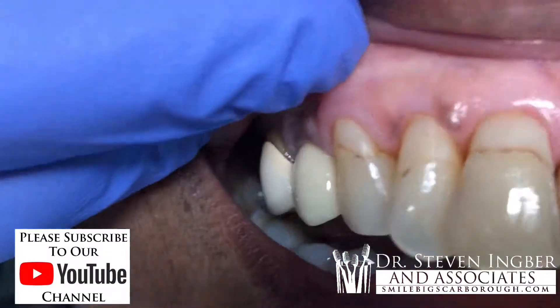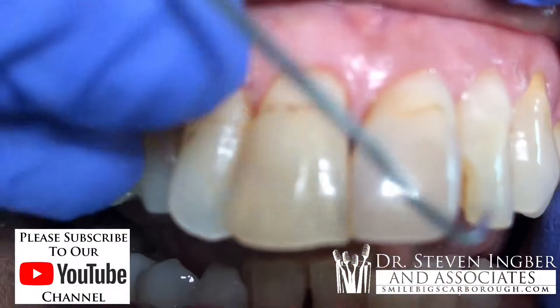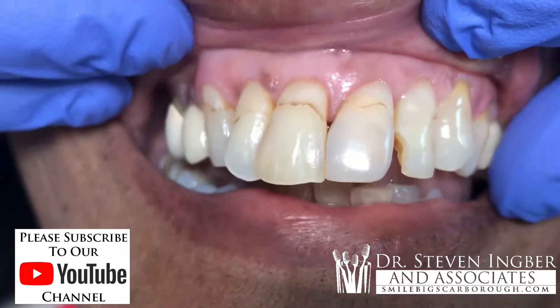As you can see here, this looks pretty nasty. So we're going to fix that up, and then we'll see how it looks afterwards.